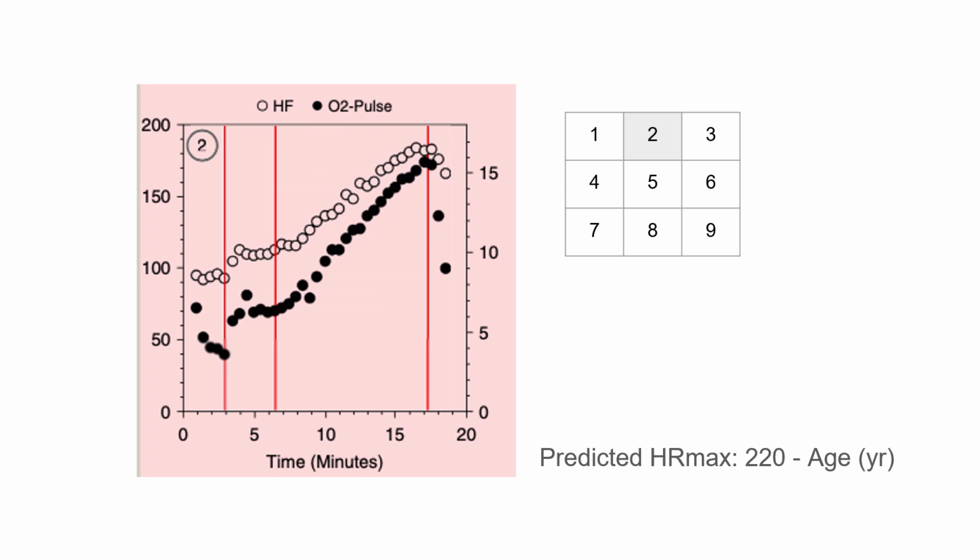And this panel is useful for identifying abnormal variations in heart rate pattern from, for example, ischemic heart disease, medications, autonomic dysfunction, or just pre-test anticipation. And a peak heart rate near the predicted maximal value is useful in supporting the impression of adequate effort, but it can be reduced. Heart rate can be reduced by medications or intrinsic chronotropic impairment, so a peak heart rate less than predicted does not necessarily indicate poor effort.